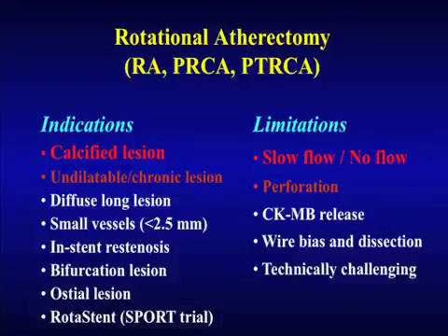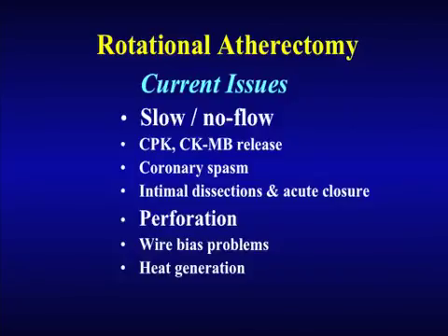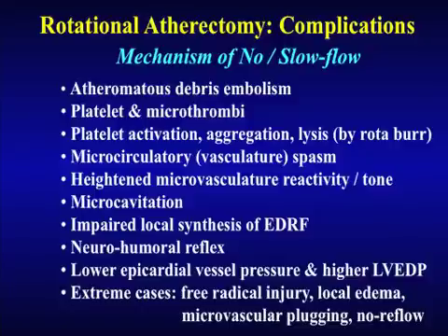Of course, perforation can occur, and I can tell you over the years now, we actually have more perforation in the non-rota cases, because in cases like this particular case, if you try to go to high pressure without doing a rotational atherectomy, your chances of perforation are much higher. And of course, there are various mechanisms for the slow flow and no flow, largely because of microemboli of the platelets and the debris causing microparticles and clogging of the microvasculature.